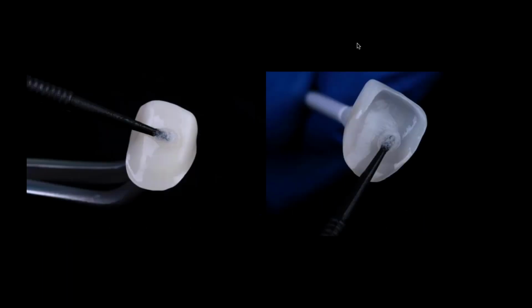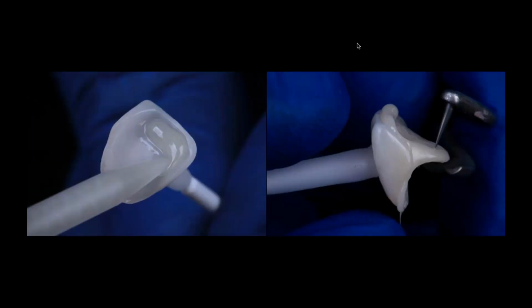So here we have the coping. After air particle abrasion, we apply the ceramic primer plus that has the MDP. Then on the feldspathic veneer, we do the hydrofluoric acid etching for 1 minute, as I showed you before, and then apply the silane coupling agent. In this case, with Panavia V5, the ceramic primer plus has both elements, conventional silane and MDP for the side of the zirconia restoration. And then we apply the resin cement in the intaglio part of the veneer, and then we can do an extraoral cementation, assuring that we remove all the excess of the resin cement.